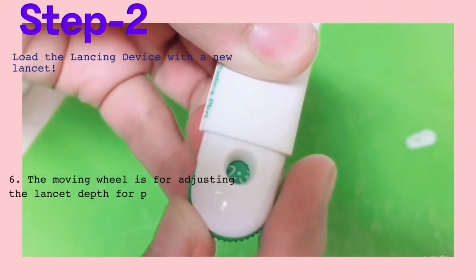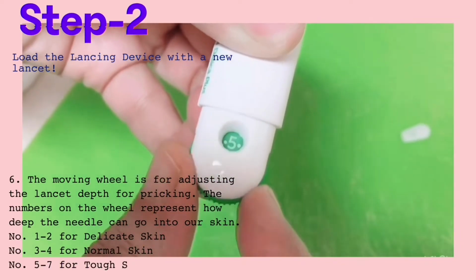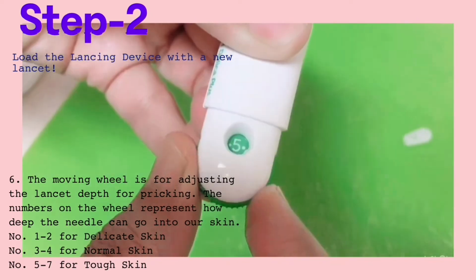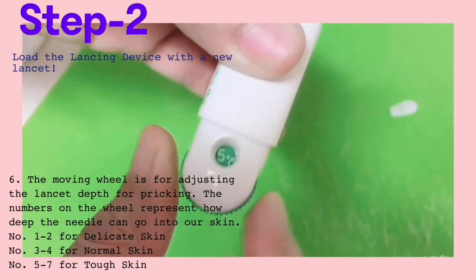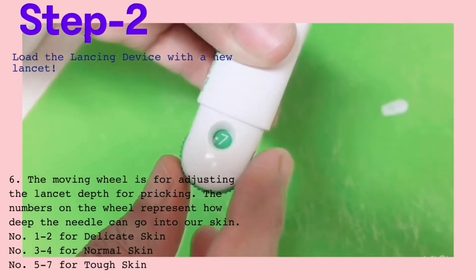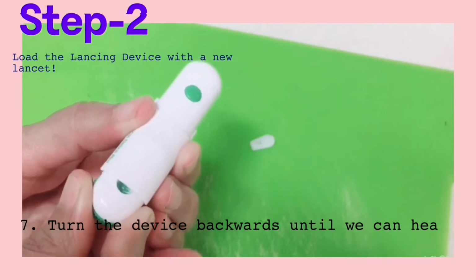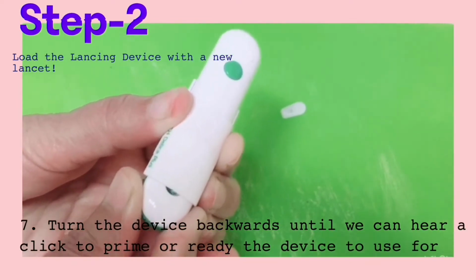Now the moving wheel that we can see is for adjusting the lancet depth for pricking. The numbers on the wheel represent how deep the needle can go into our skin. So number 1 to 2 is for delicate or thin skin. Number 3 to 4 is for the normal skin. And number 5 to 7 is for the tough skin. So pick whichever number you need. Turn the device backwards until we can hear a click to prime or ready the device to use for pricking. And then set it aside.